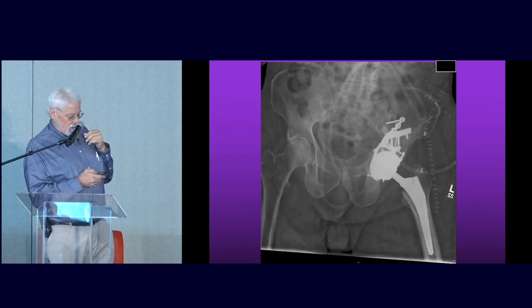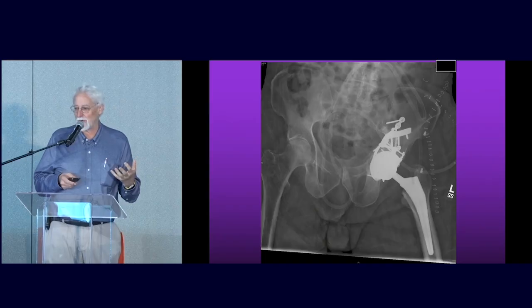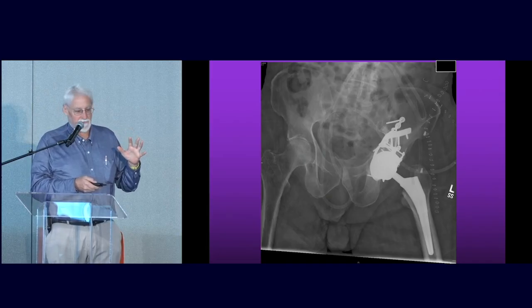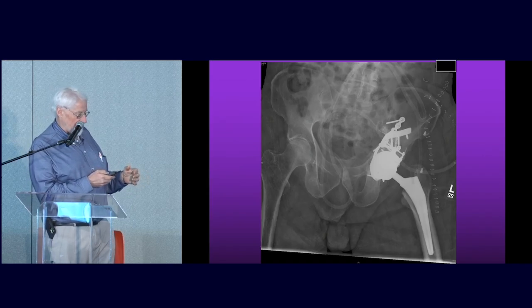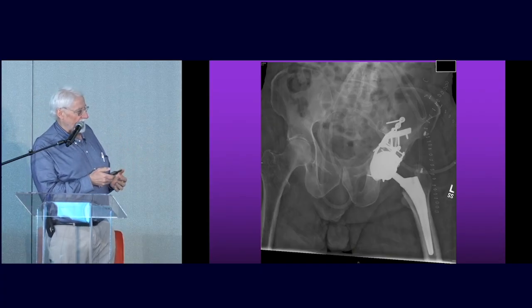And what you may notice is all of those screws and plates are still in there. So I didn't take any of those out. I actually did a different approach. I did an anterior approach. And this is like a T-plate, and you can't really get this because we didn't mass produce it, but now we have a Stryker one that does essentially the same thing. What I did, I used to call this the Texas T, and it kind of runs down the pillar of your gluteal, and then I ran essentially a rami plate over the top of it just to hold it, and so I stabilized the bone with that and did an anterior total hip.